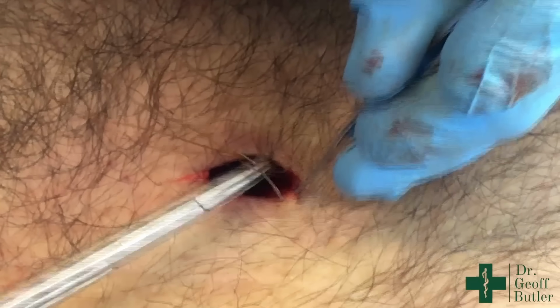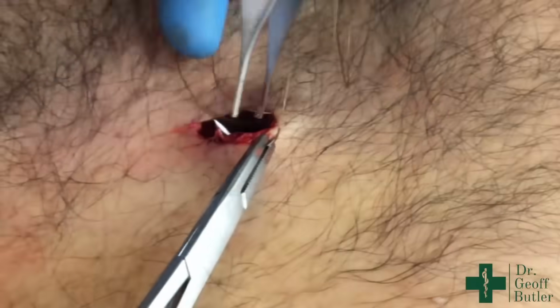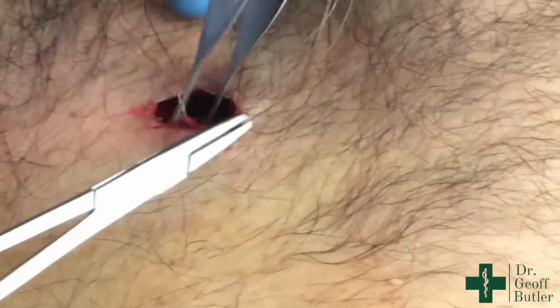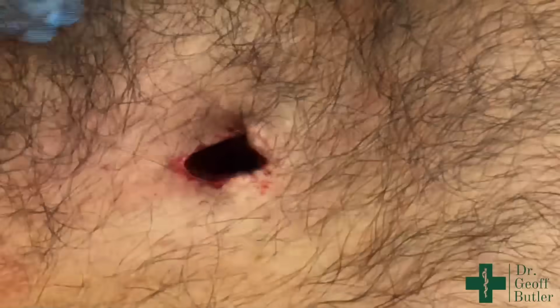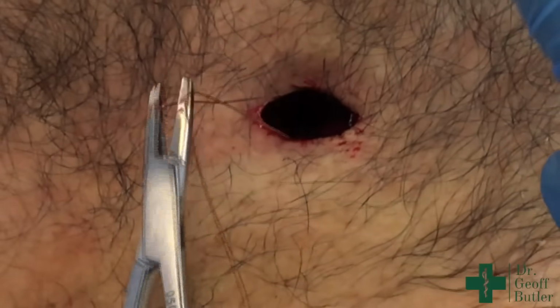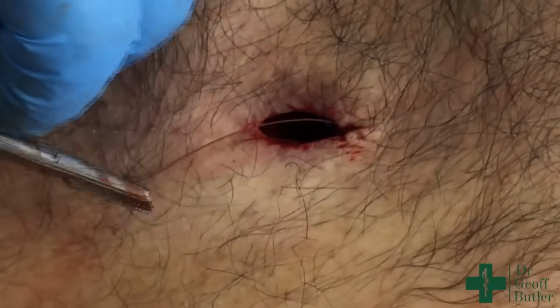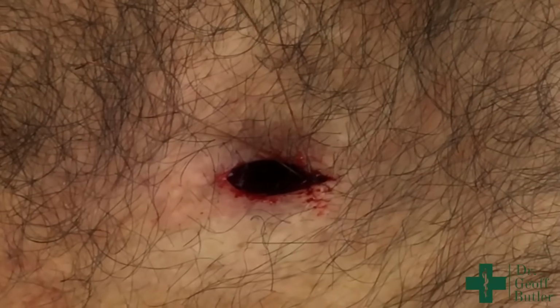This is certainly a case where you need the Adson's forceps, or this becomes even more challenging. The Adsons are the ones with the teeth on them. Because it's grabbed so much, when I do sutures, I just do one loop, and then I pull it through. This is almost like you're tying a shoe. But this will allow tension to hold.